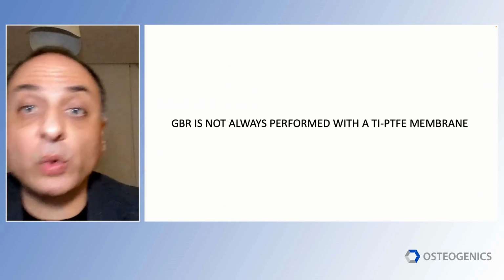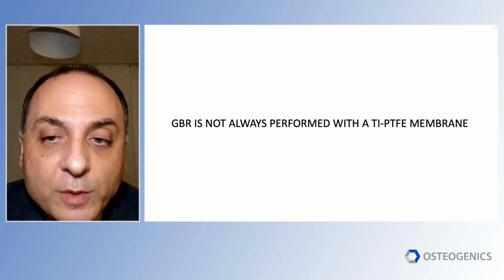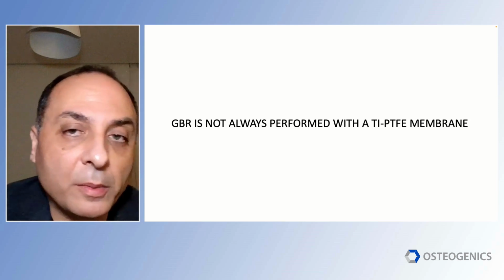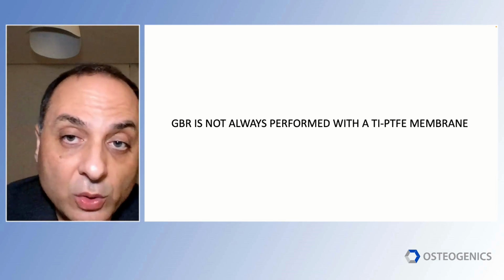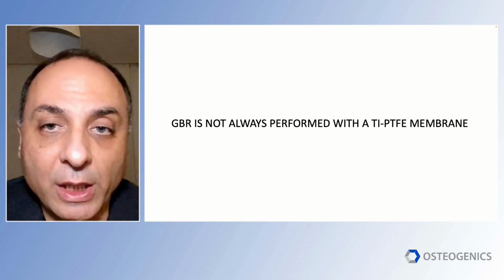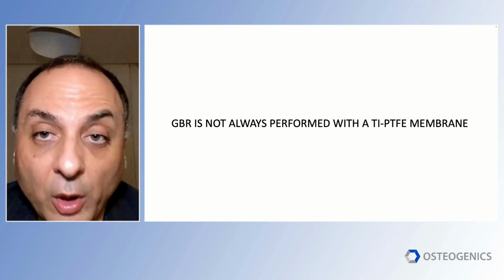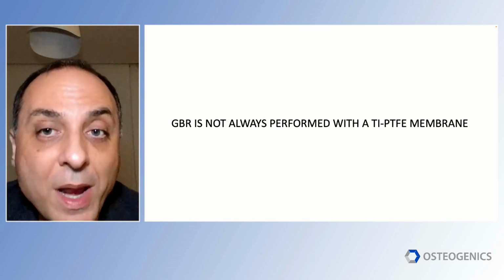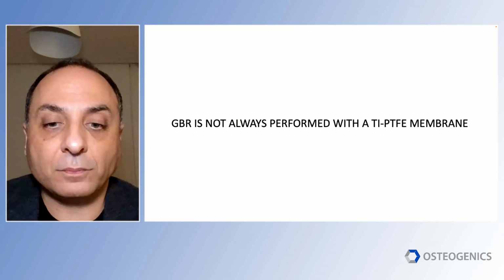So we've presented 2 cases with titanium reinforced membrane, but GBR is not always performed with a non-resorbable membrane, with a titanium reinforced membrane, because collagen membranes have their place too, have their lion's share, I would say, because most of the membranes used among dentists are collagen membranes. So what about collagen membrane in GBR?